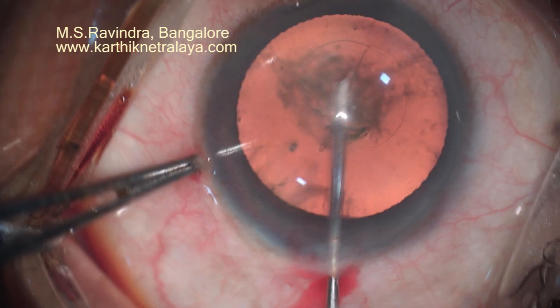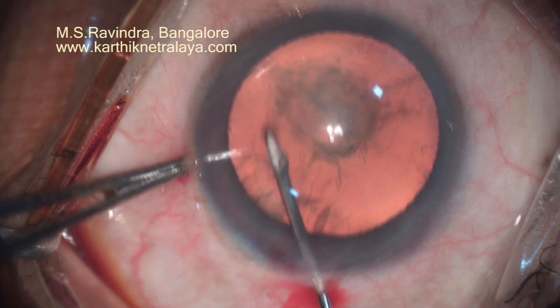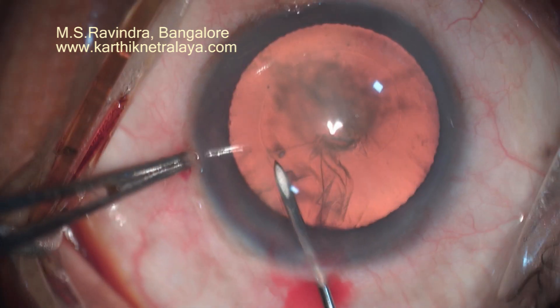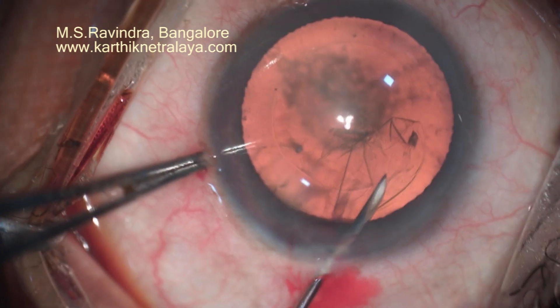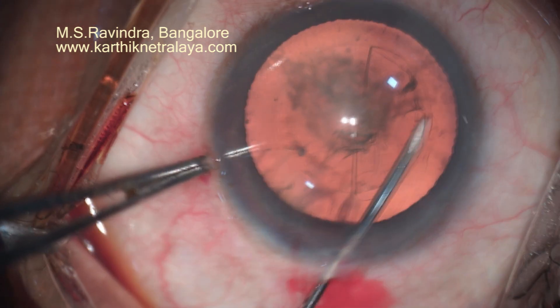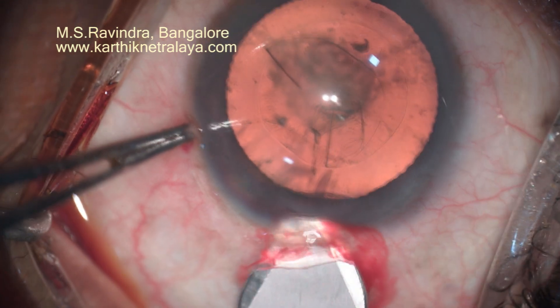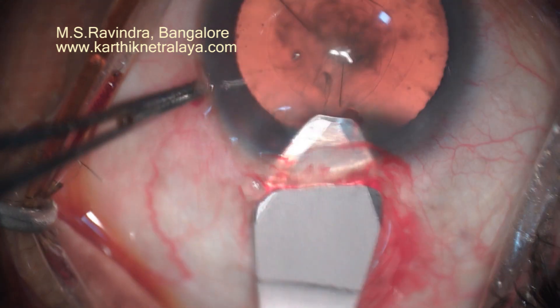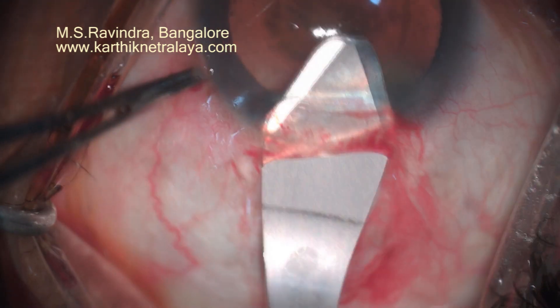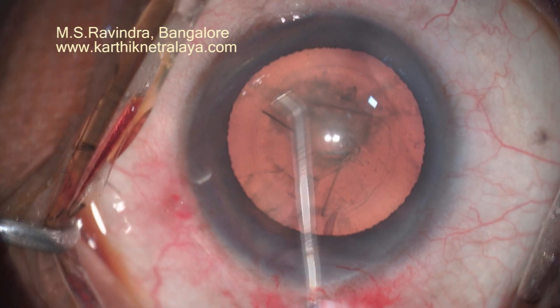The chamber is filled with HPMC visco. The entry through a pinpoint opening through the floor of the tunnel at the limbus has many advantages. The visco injected into the anterior chamber remains there — it doesn't leak out, as you can see in the video — so the depth of the anterior chamber remains as much as when you injected the viscoelastic.